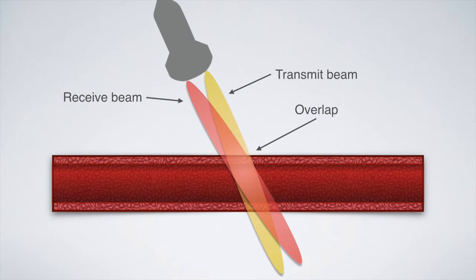Cardiac ultrasound primarily uses continuous wave Doppler. A continuous wave transducer is designed to have one part of the transducer consistently producing the sound waves and the other part of the transducer consistently receiving the sound waves that are reflected back. A continuous wave transducer can also accurately determine the speed at which blood flows.